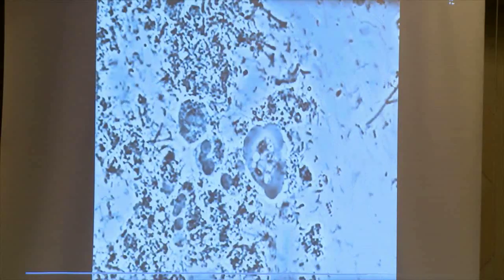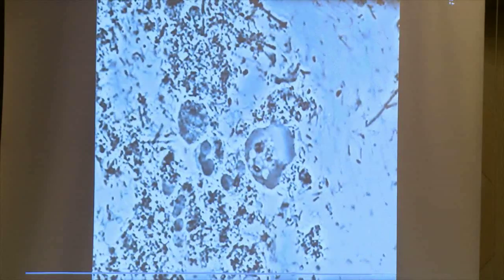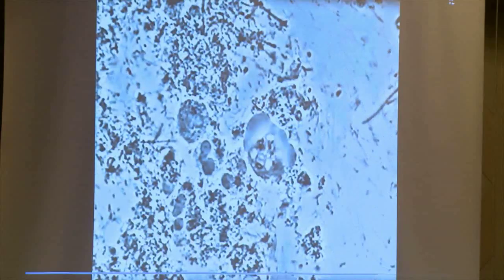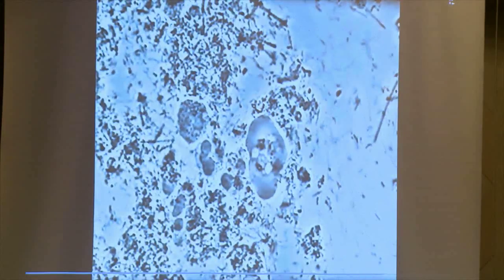Might be too far along in the presentation. Again, another very active amoeba. Usually when there are amoebas present, they really like a deep, dark, moist area. They don't like oxygen; all of this bacteria is anaerobic. Amoebas are a one-cell animal, so you know that there's a significant amount of infection present when they are able to survive. Then you just decide what treatment protocol you're going to use to get rid of them.